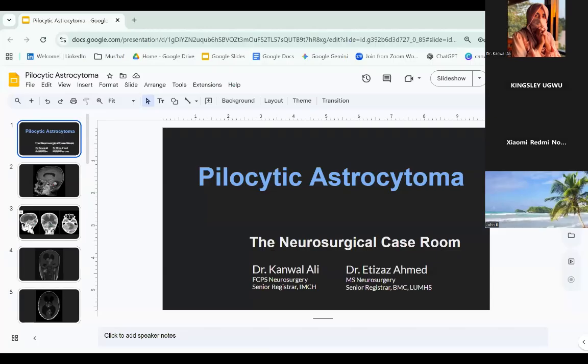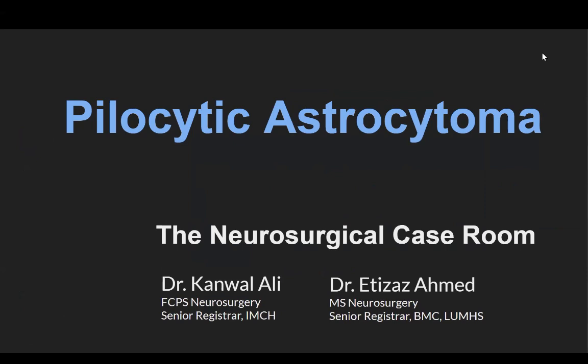Okay, so let's begin, inshallah, today's session. We are going to cover pilocytic astrocytomas today. This one is going to be a radiology heavy session because pilocytic astrocytomas have a very interesting radiological spectrum, and I wanted to share a lot of it.